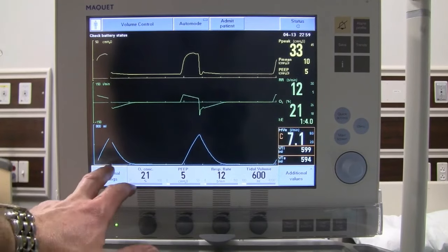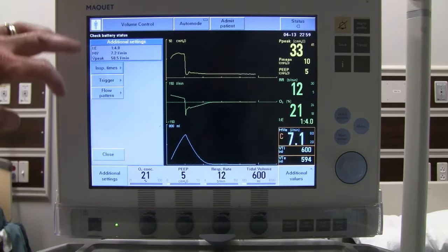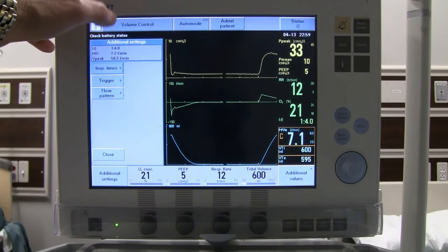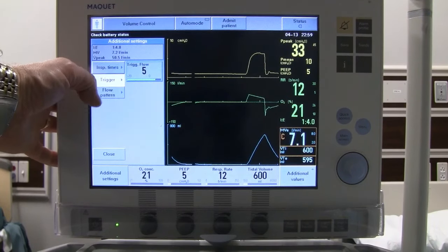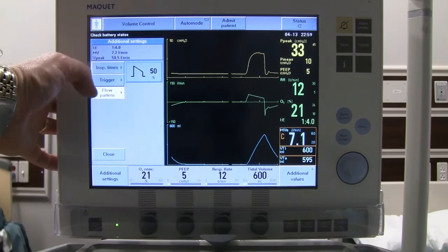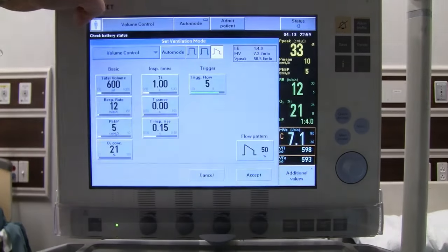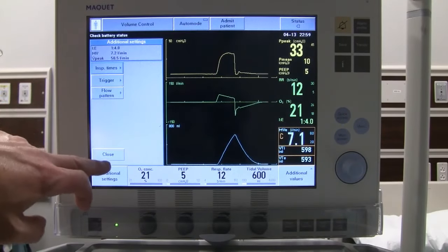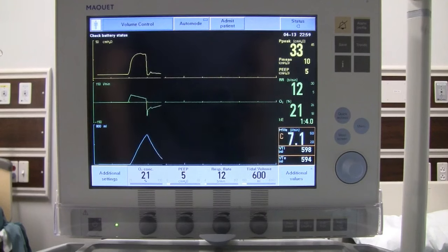There's also an additional settings button on the screen that provides quick access to I-time, triggers, and flow patterns — the same items found in the primary ventilator settings screen, just quicker to reach. That covers volume control on this ventilator.